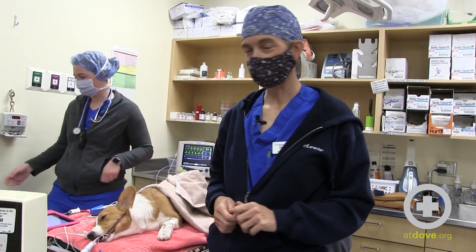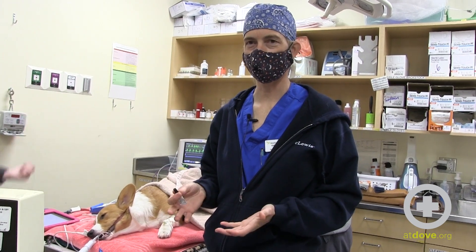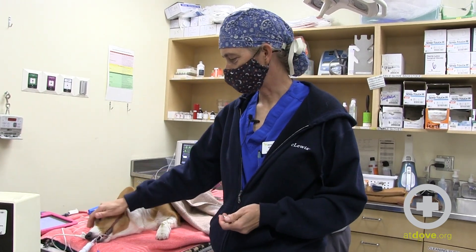Hi, this is Coby Richter. I'm one of the surgeons here at Deb Lewis, and we're just very briefly talking about lubricating the eyes on our surgical patients.